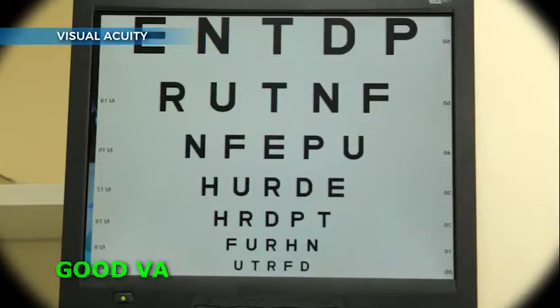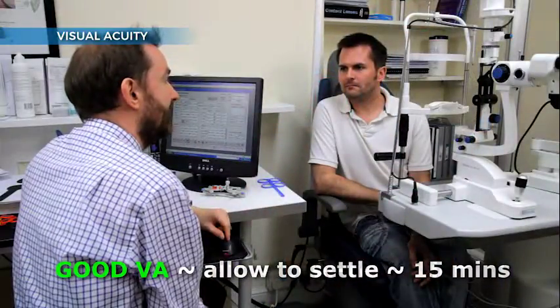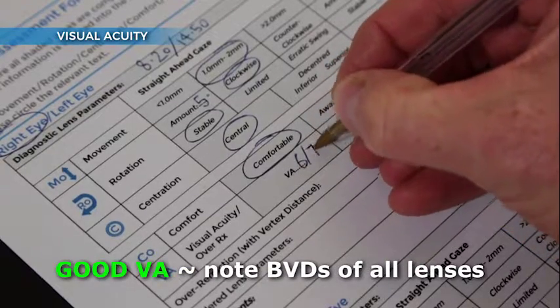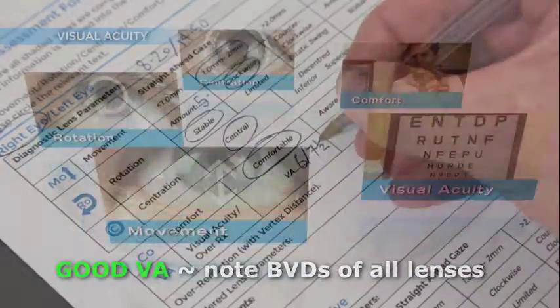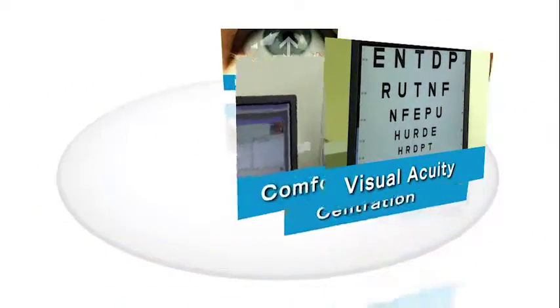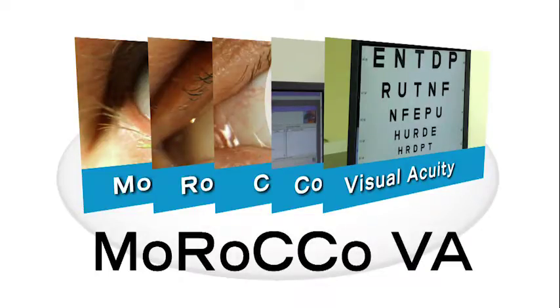Once you are satisfied with visual acuity, allow the lens to settle for around 15 minutes and then refine the over-refraction, noting the back vertex distance of all lenses. Then perform a final assessment of the 5 fitting characteristics using Morocco VA as the guide to ensure the lens is fitting optimally. In approximately 20% of cases, an optimal fit may not be possible with standard periphery lenses.